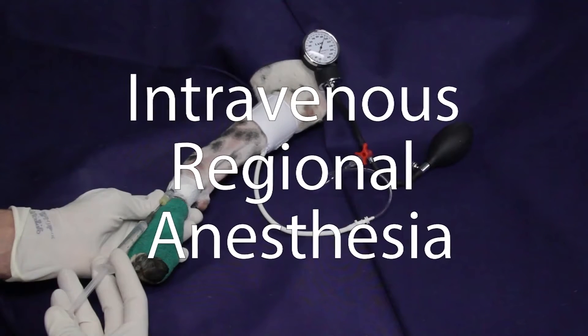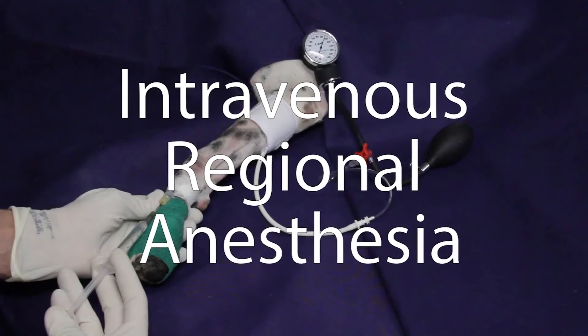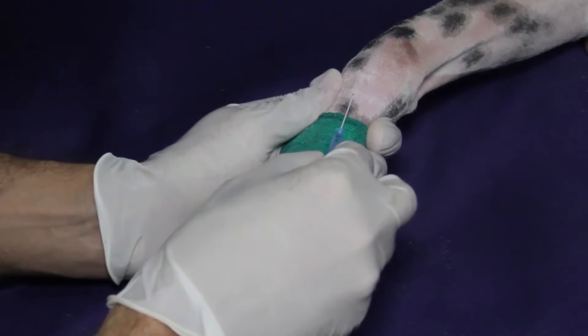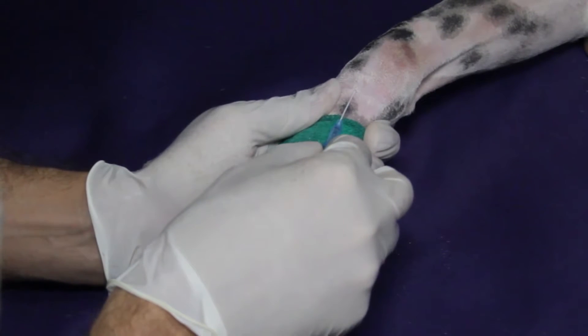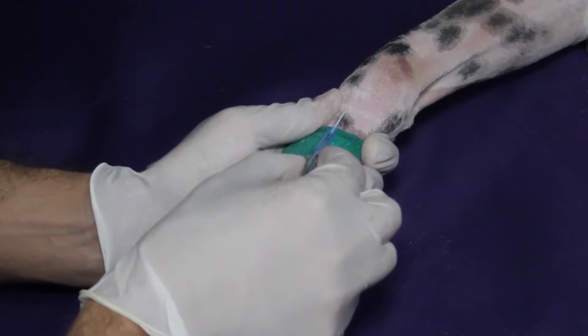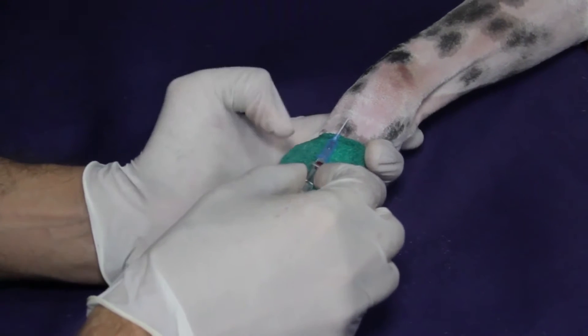Intravenous Regional Anesthesia. After surgical preparation of the affected limb, an intravenous catheter is inserted close to the surgical site, ideally in a retrograde manner, and fixated in place.